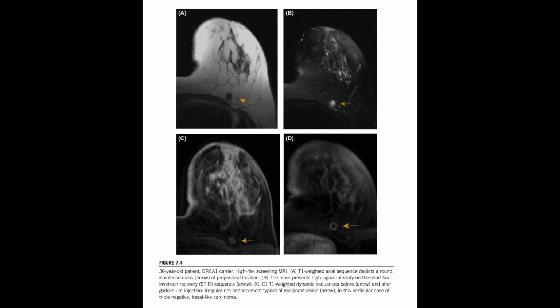You're thinking fibroadenoma. But I know it's not the whole picture. It's not. A cancer could look deceptively smooth, couldn't it? Why isn't a perfect shape enough? Because morphology tells us about the structure, but it doesn't tell us about the behavior. A lesion can look perfectly smooth and oval, but if its internal biology is building chaotic new blood vessels to feed itself, well, you could mistake a fast-growing cancer for something safe.